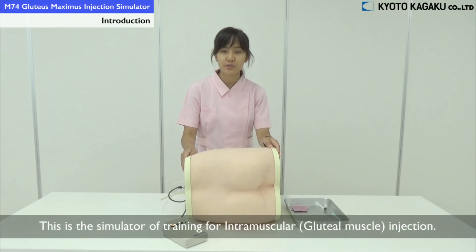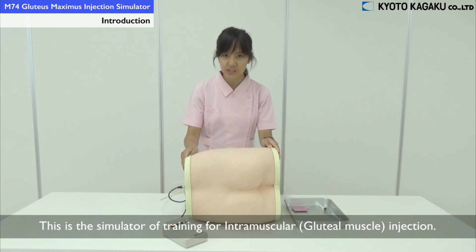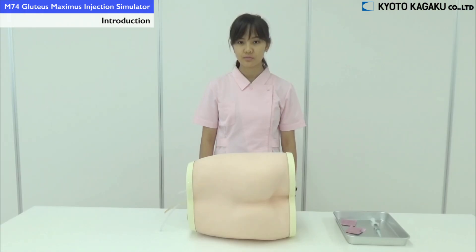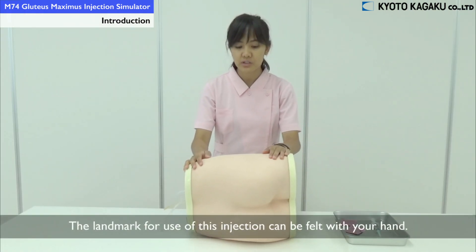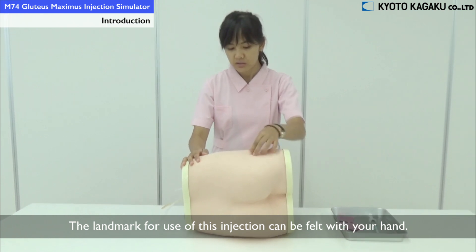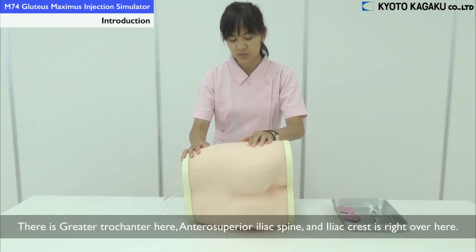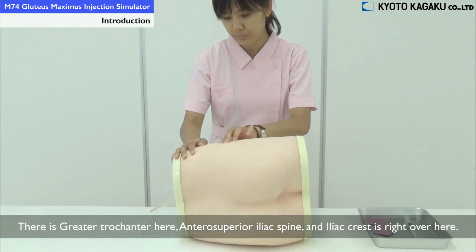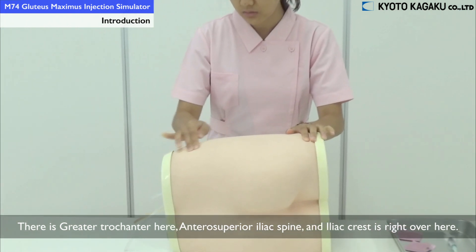This is a simulator used for training intramuscular injection at the dorsogluteal muscle. The landmarks used when the injection can be felt with your hand: there is the greater trochanter here, and then the anterior superior iliac spine, and the iliac crest right over here.